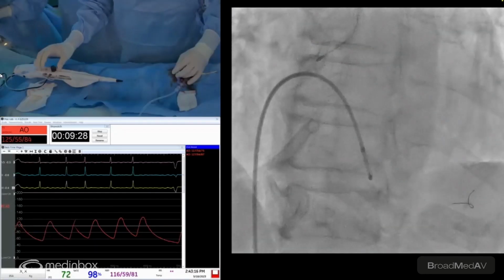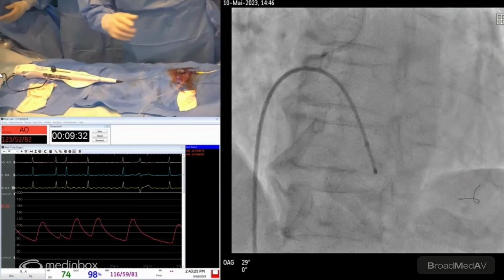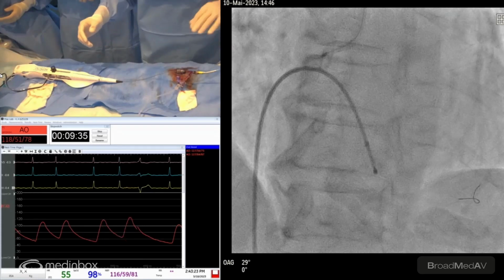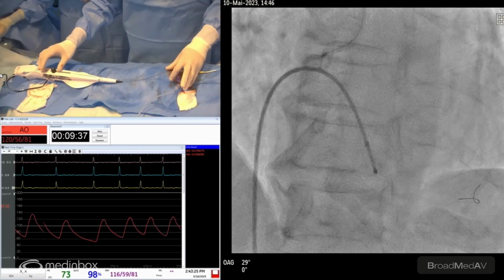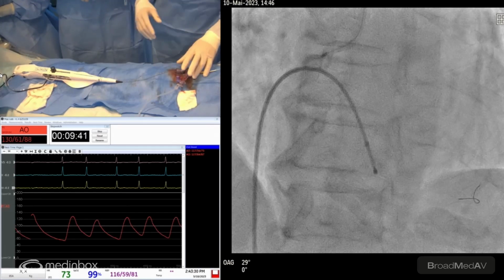You see the burr didn't move. That means I had a little bit of tension in my system. And so, ready to go. Make sure that you have someone watching the monitor, because you can't see everything. This is a wire, burr, lesion, patient. You have to have someone helping you, giving you cues and tips.